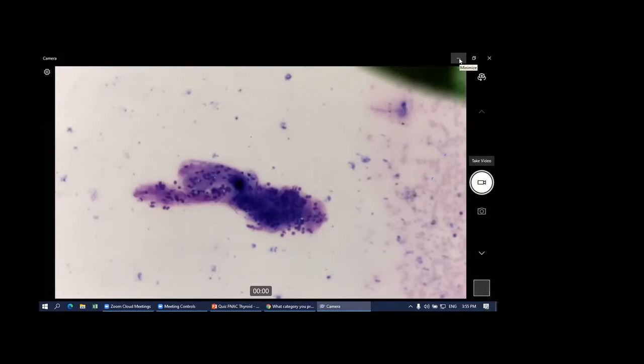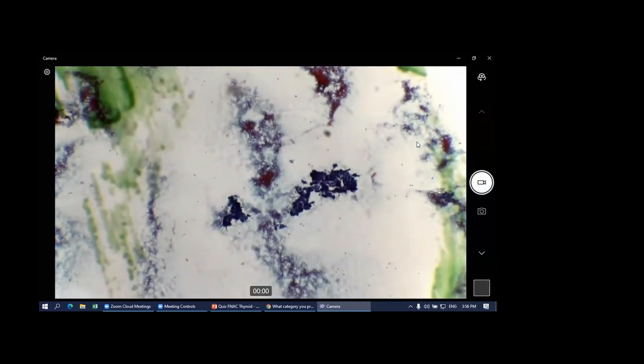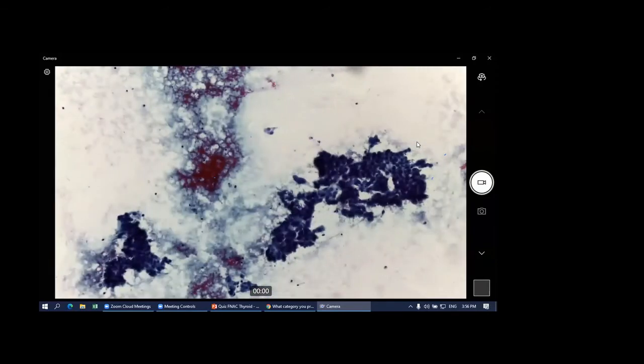Okay. So let's go to one interesting case that at least I have the histology. Okay, this is more interesting. Okay, area number 1. Wait, let me go to the area. Okay, can you see that? Alright, let's just look first, one to two seconds. Okay, let's go high power. Can you see that? This is actually PEP, yeah?